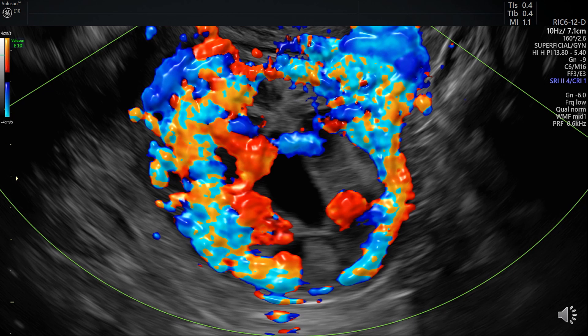The interstitial part of the tube has a significantly greater capacity to expand before rupture, because of its thickness. Rupture can result in catastrophic hemorrhage with massive blood loss from the vascular anastomosis between the uterine and the ovarian arteries. This can be seen here demonstrated by Doppler flow.